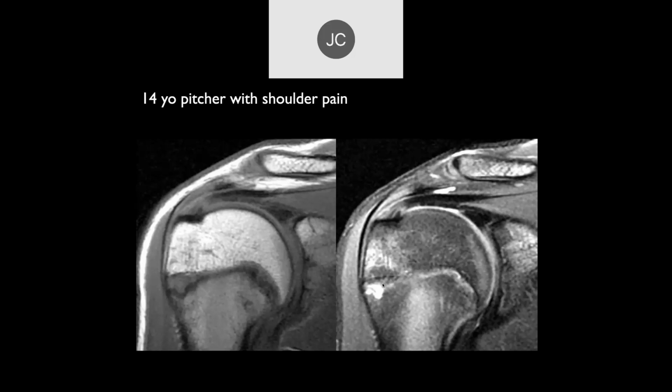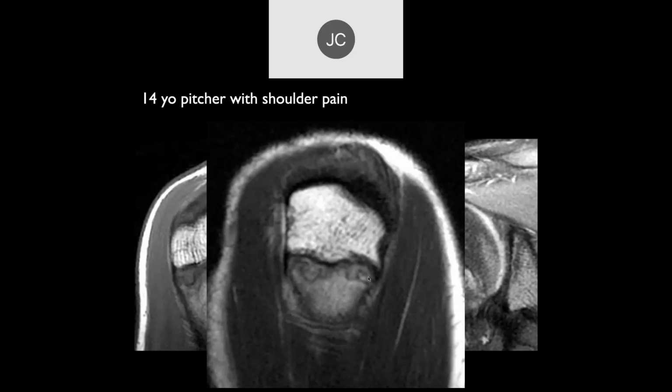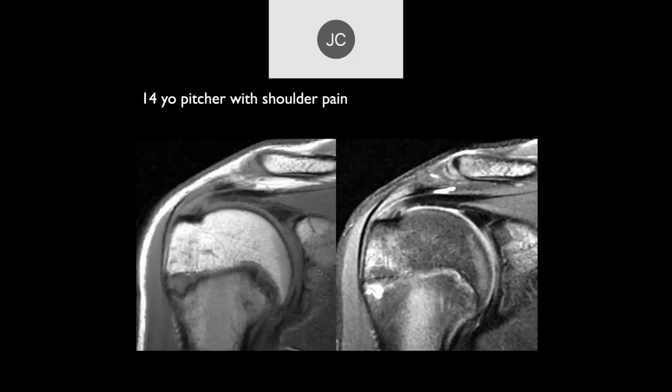Okay, a 14-year-old pitcher. You want to give us a Salter? So I guess it's probably a Salter 4, right? Well, what's a Salter 1? It's not displaced, so it's basically a Salter 1. Salter 1 is basically a fracture along the growth plate. And if it's picked up early and treated early, it has a very good prognosis. This is very active tissue and it can heal well.